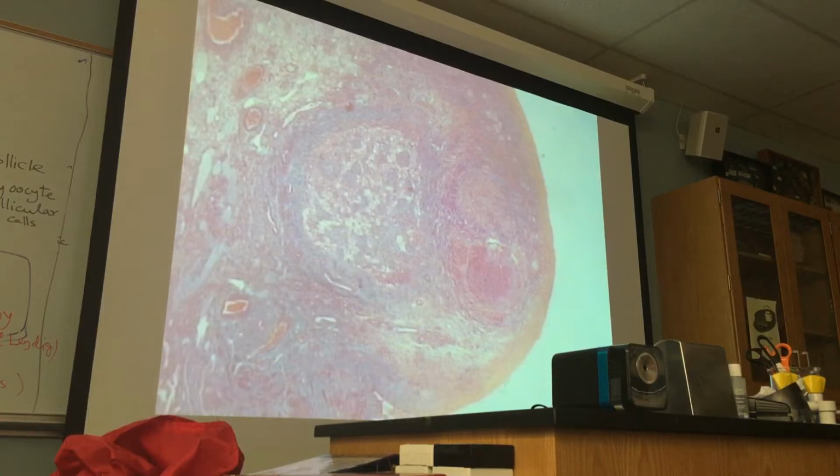Okay. When there is ovulation, if you go to the diagram number 28.18, 28.13. Look at that. Corpus hemorrhagicum. So for histology wise, we wouldn't be able to identify. No, if I want you to identify corpus hemorrhagicum, I have to use the diagram or photograph. Okay?